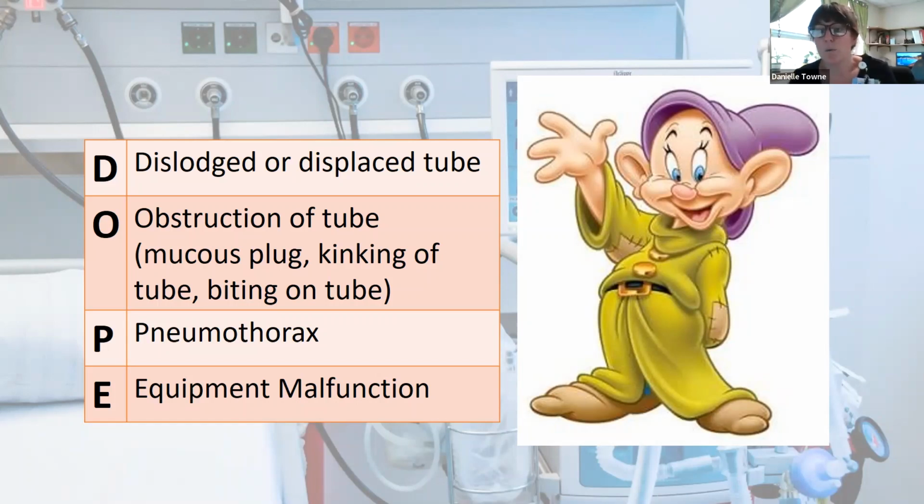Pneumothorax. A sudden or worsening pneumothorax can cause a sudden spike in your PIPs and P-plats and cause significant alarming. You'll also see changes in your vitals depending on the severity, right? Tachycardia, hypotension, hypoxia. Listen to your patient, assess their chest rise. If you have time to get a chest x-ray, then great. You can assess the situation if the patient's stable enough to do something like that. Otherwise, you can consider a needle decompression if your differential is high enough that this is indeed pneumothorax.